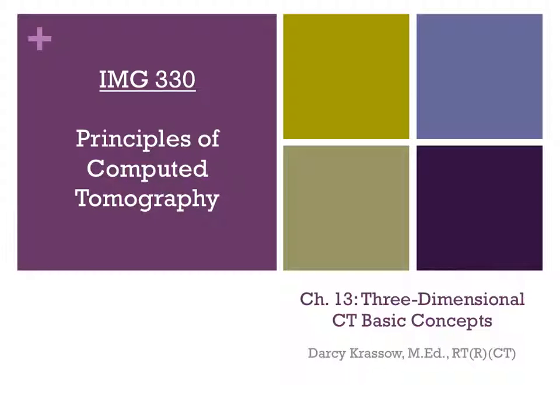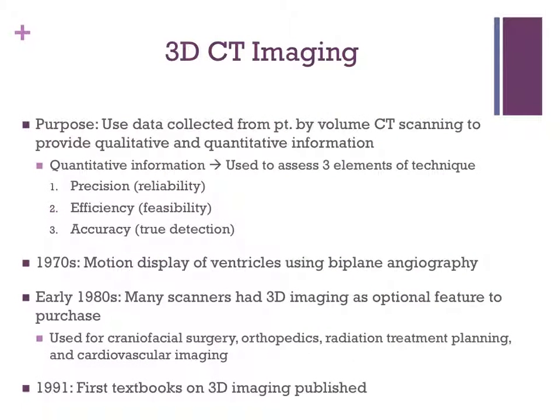Chapter 13, Three-Dimensional CT Basic Concepts. The purpose of 3D imaging is to use the vast amounts of data collected from the patient by volume CT scanning to provide both quantitative and qualitative information in a wide range of clinical applications.